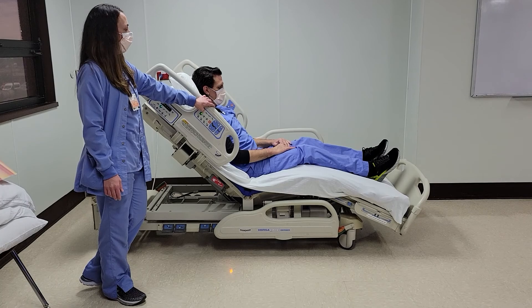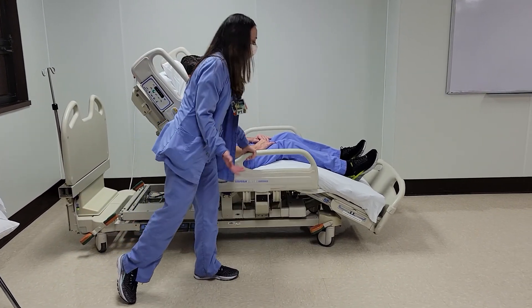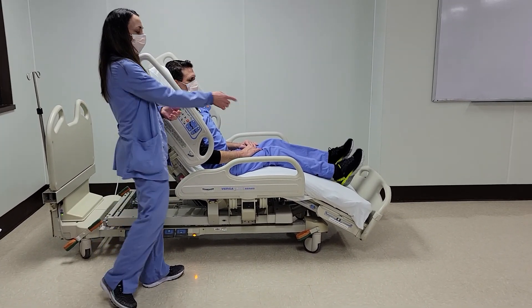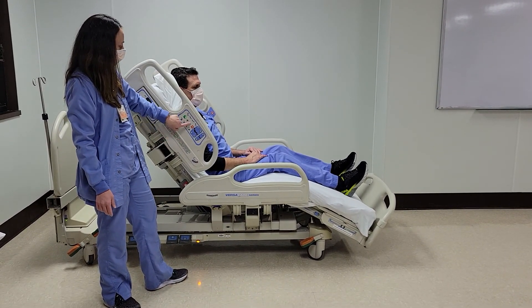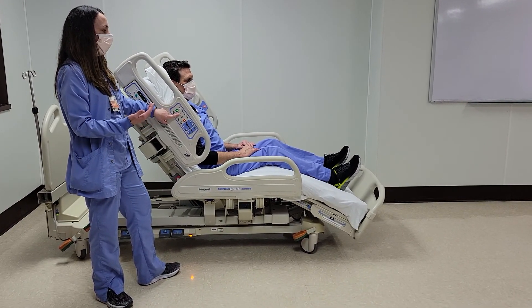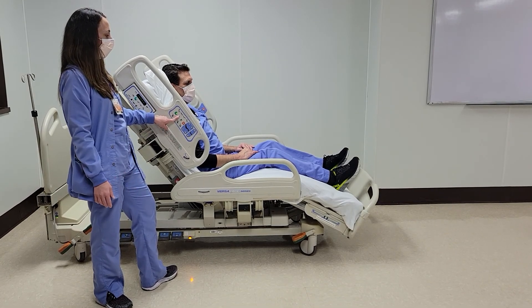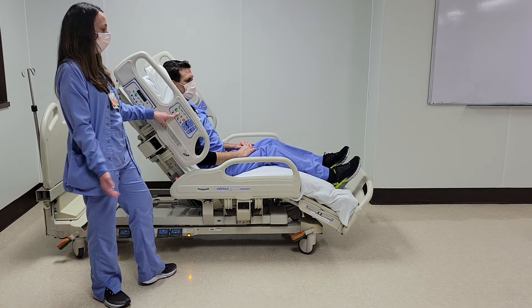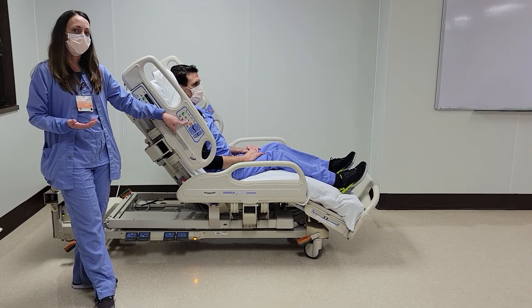The bed is going to do the work here. Once you get the bed into this position, put the rails up just for safety. The foot plate of the bed is also something that can be adjusted — hit the key button and there are arrows with some feet icons. We like to bring it in; it gives the patient a sense of security and helps prevent further sliding down the bed. Keep in mind that if it's a tall person, their feet might be jammed when you flatten the bed, so you'll have to lengthen the bed again.